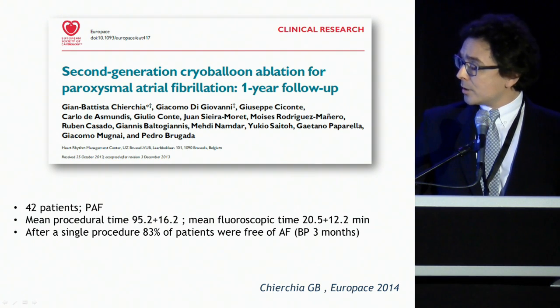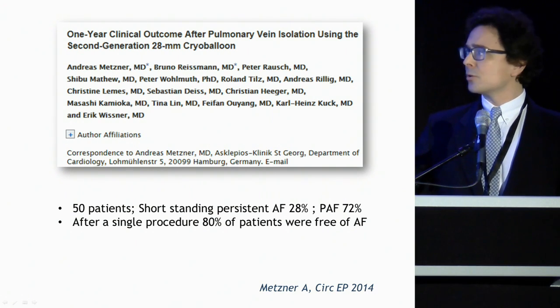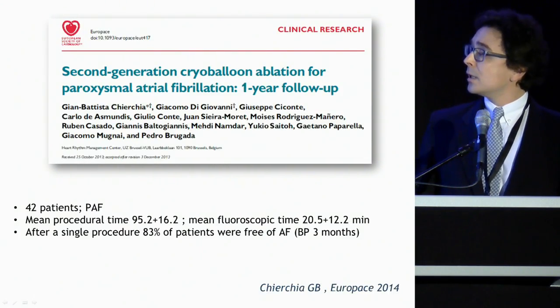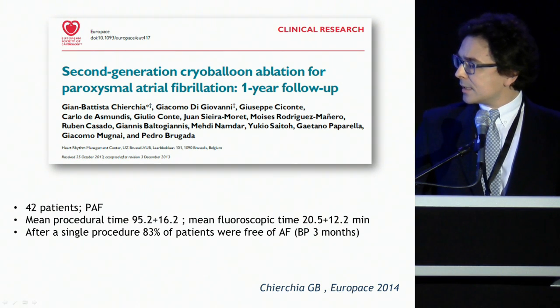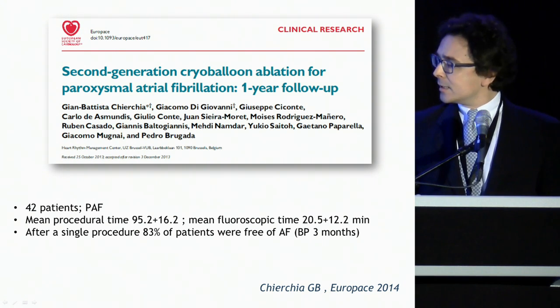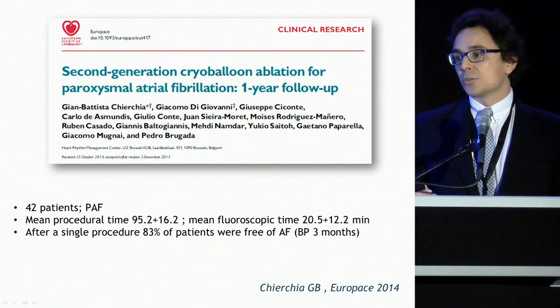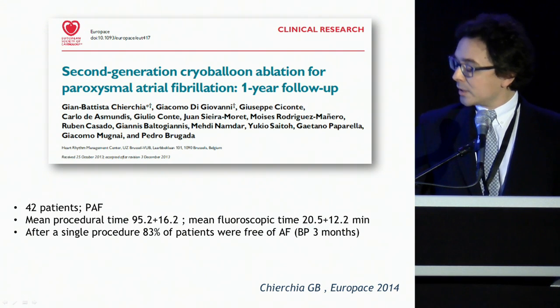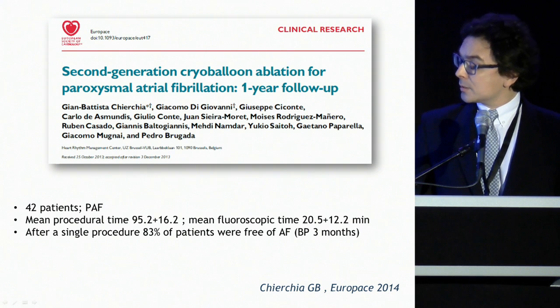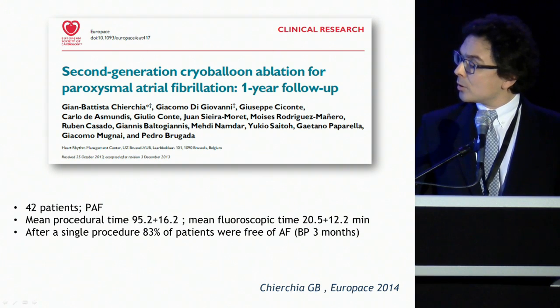And at 1 year follow-up, oops, sorry, how do I go back? Can you go to the previous? Thank you very much. What you can see is that after a single procedure, 83% of patients were free of atrial fibrillation. We know that freedom of atrial fibrillation means they did not present atrial fibrillation anymore, whether they were having asymptomatic episodes or not. This of course will remain unknown. But 83% of these patients were free of symptomatic atrial fibrillation and did not present any trace of atrial fibrillation on the follow-up.